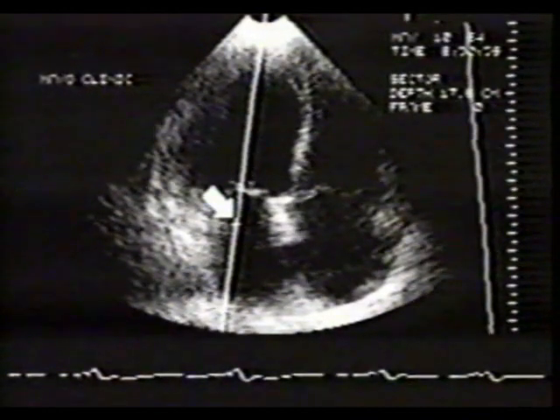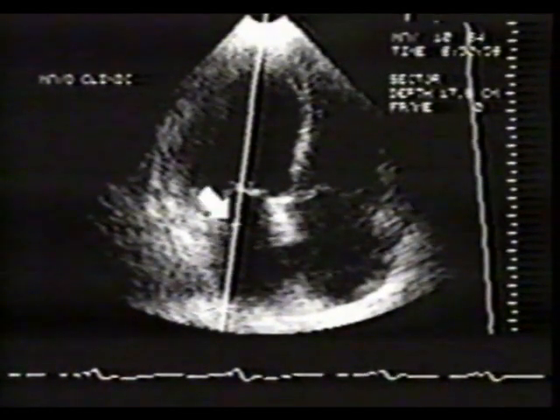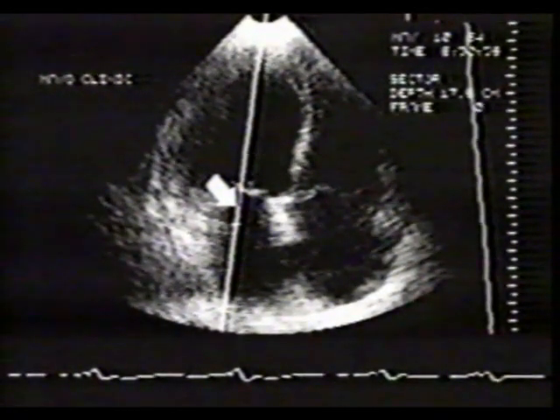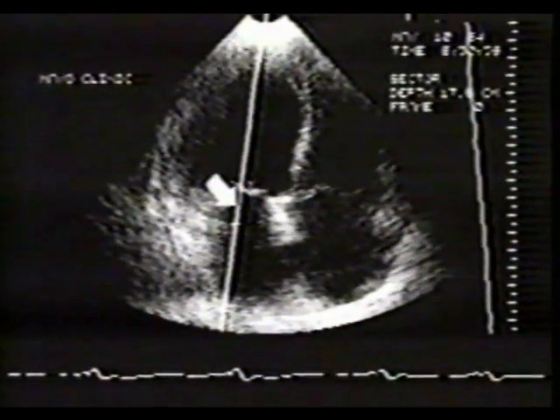This particular instrument provides a movable cursor that the examiner can steer from side to side. Other Doppler instruments have a cursor that occupies a fixed position on the screen. The examiner must then manipulate the 2D image so as to bring the region of interest in line with the Doppler cursor.